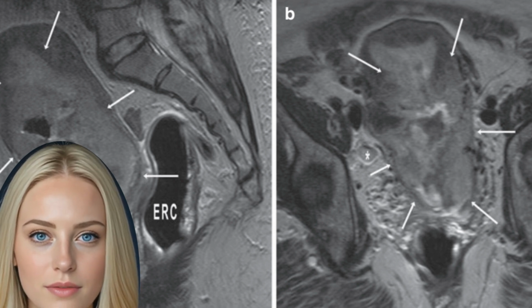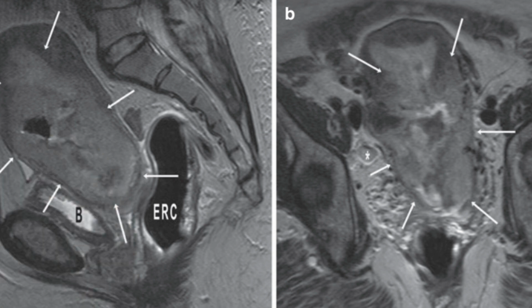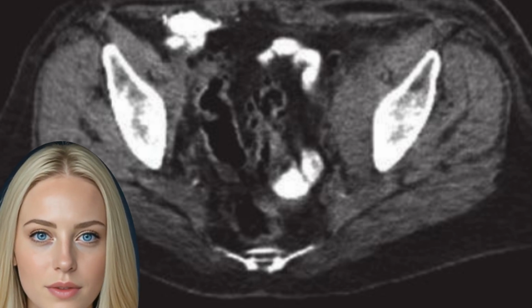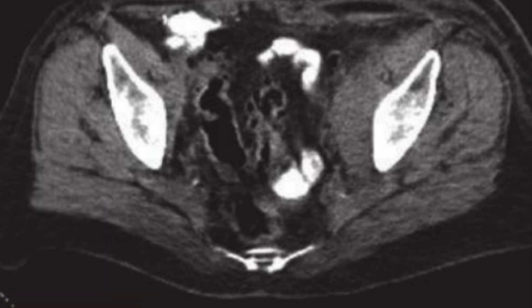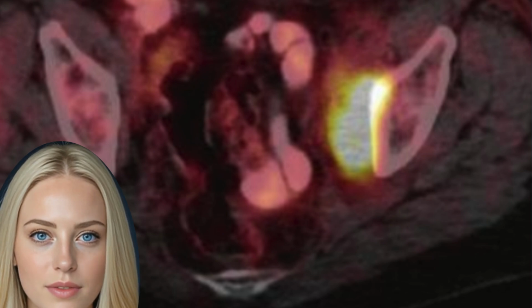In recent years, diffusion-weighted imaging gains more attention. This imaging technique was designed to depict alterations in thermally induced random, Brownian motion of water molecules within tissues, and the degree of this motion is known as diffusion-weighted MR imaging, DWI. It can be performed quickly, without the necessity of contrast IV. The technique yields qualitative and quantitative information about cellularity and cellular membrane integrity.